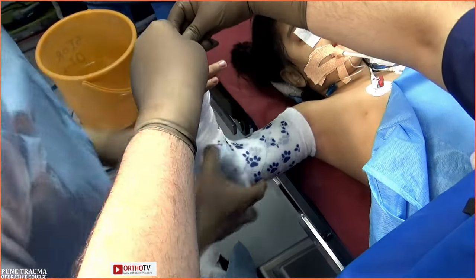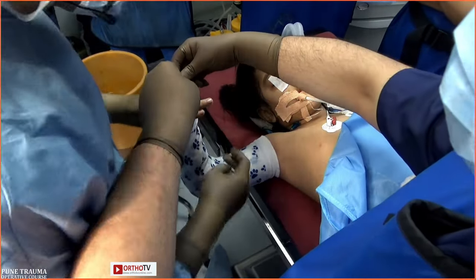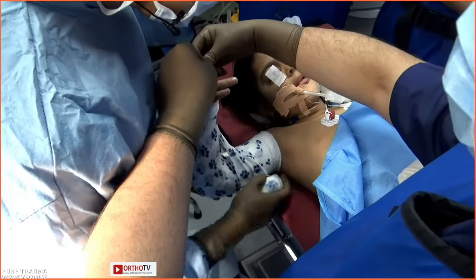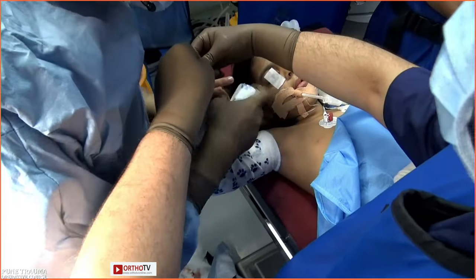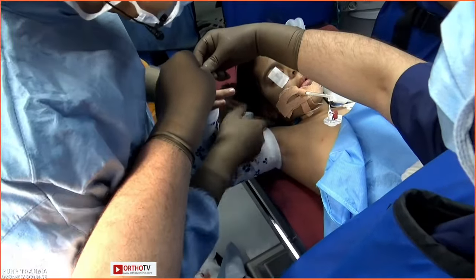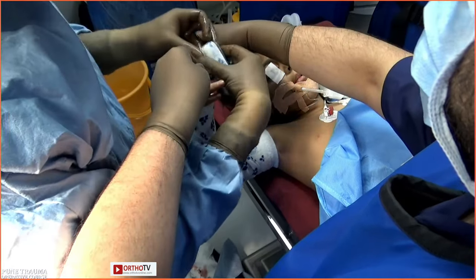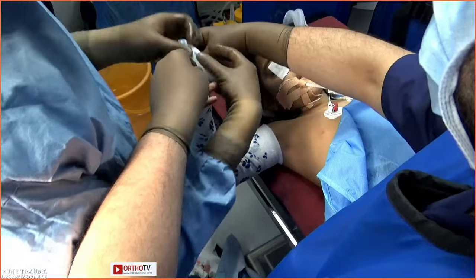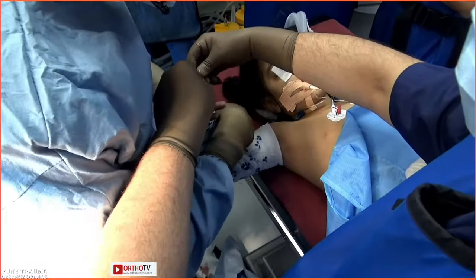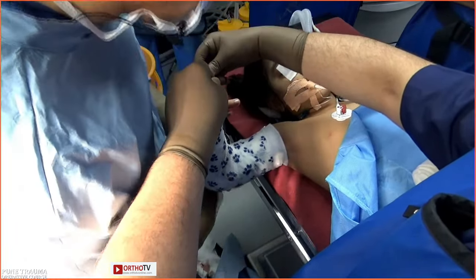I have casted all my supracondylars primarily, and after you put the cast, please don't flex the elbow. So what I do is a figure of eight. From here I go here and come back here, without putting flexion material and flexing it. This is an easy way to keep whatever flexion you want without flexing, with plaster material going into the crease. Then you can just cover it up. So the flexion blisters and problems which happen in the flexor crease are avoided.